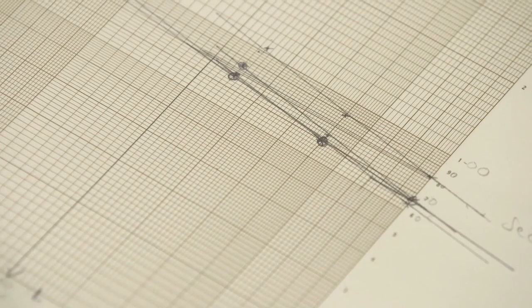So we have not met the criteria for a valid assay. This sample is a patient who has lupus anticoagulant. The APTT reagent we've used for this factor VIII assay contains a low concentration of phospholipid. It's sensitive to, it's affected by the presence of lupus anticoagulant.